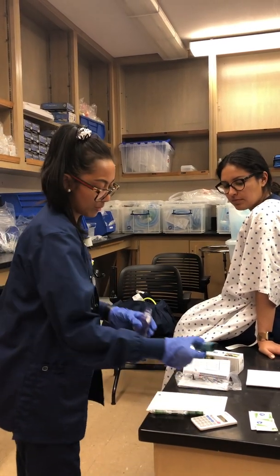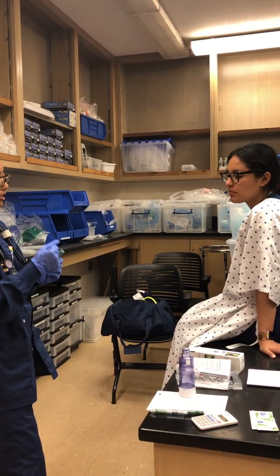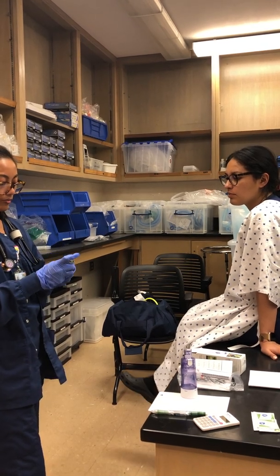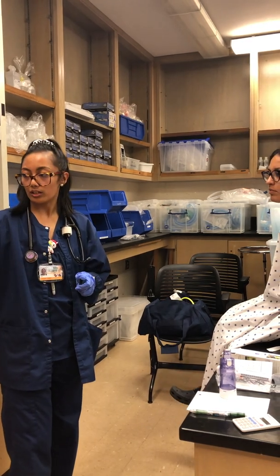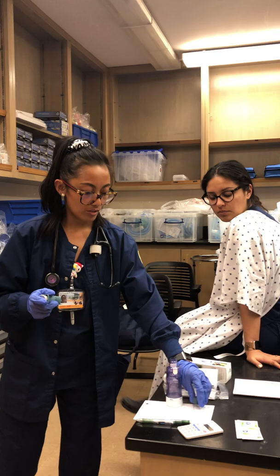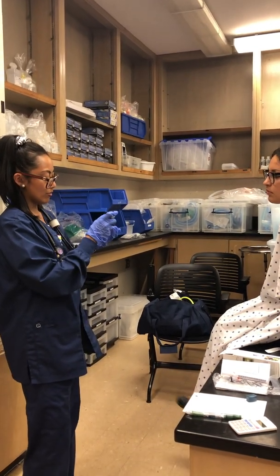So when assembling the metered dose inhaler, since this is going to be your first time using it, we want to warm it and prime it. So to prime, we just attach, we shake it a little bit, and then spray it away from us at least once, like that. Okay, so that's how you prime it. And then to use, we just attach it to the back part of here.